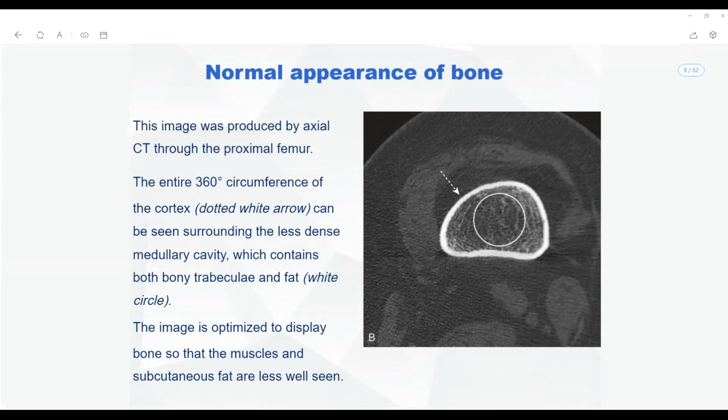That's the reason I asked you to know the structure of all the bones. It will be a little confusing later on if you don't know the cross section of the bones, or what bone we are looking at. See, I am actually looking at the proximal part of the femur. Greater trochanter, lesser trochanter, interesting, I don't find them. Let me show you what exactly I'm talking about. Just give me a minute.